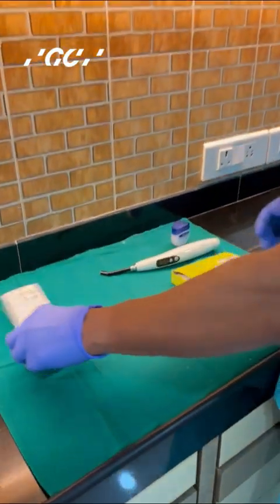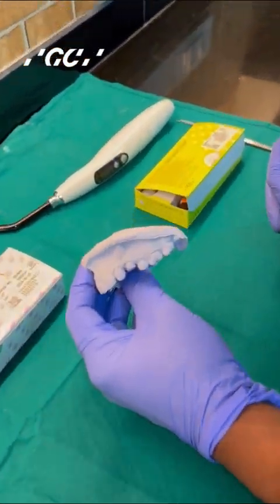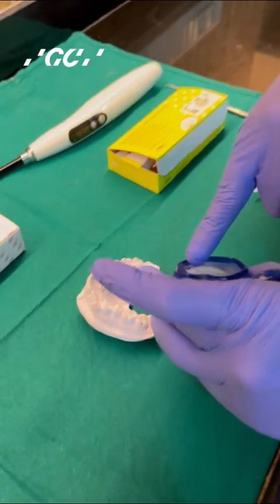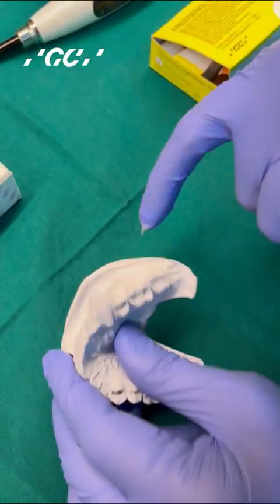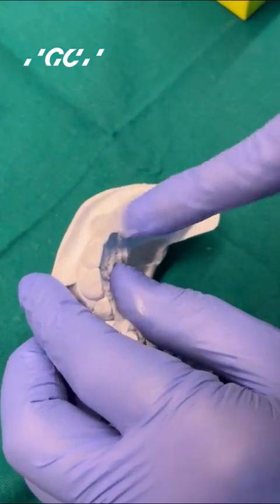The product that I am going to use here is Revotec LC from GC. The patient here has got a crown prep done for the upper left first premolar. This crown can be done directly in the patient's mouth or it can be done on a model. Wherever you do it, first coat the tooth that is to be prepped with a little bit of Vaseline — not too much, else the material will get a little soggy.